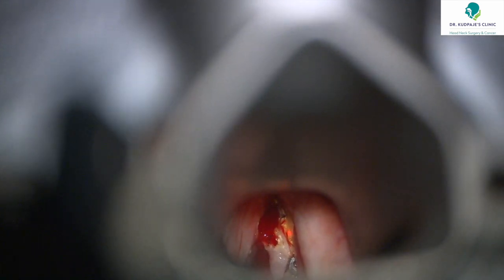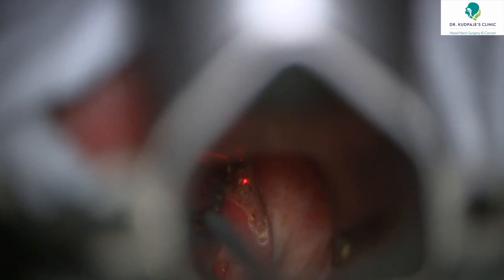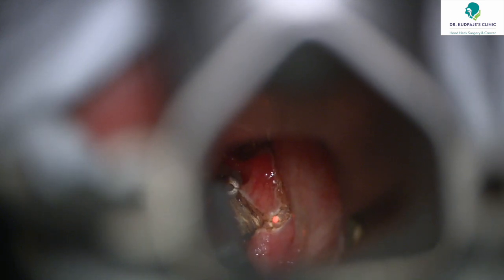The incision started with the exposure of the anterior commissure area, and we encountered a spurter, which usually occurs in this area, which was managed with the monopolar suction cautery. You can appreciate the ligament, which we look at closely, and there was the thyroarytenoid muscle or the vocalis muscle, which appeared free, which was the depth of the resection. Then we did a transtumoral resection, ascertained the depth.